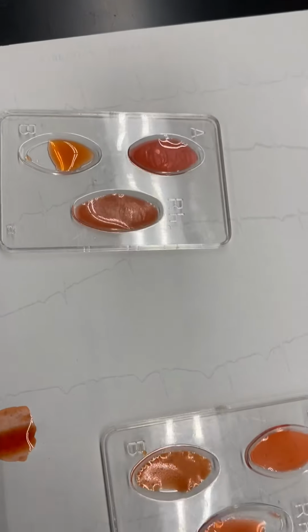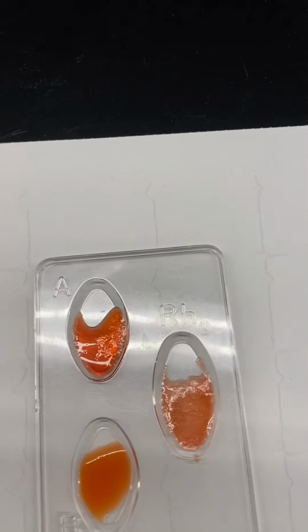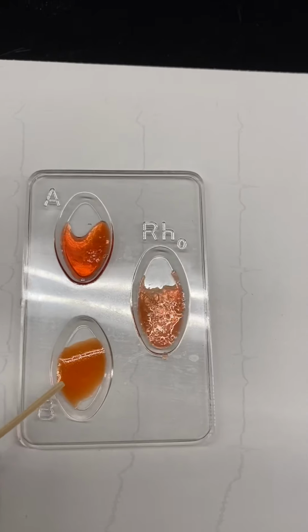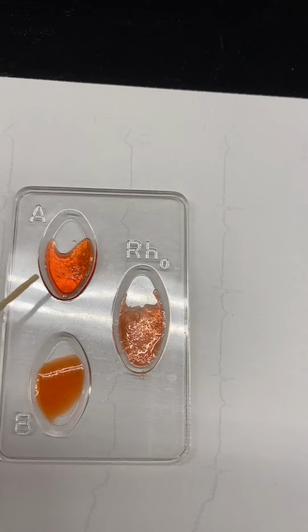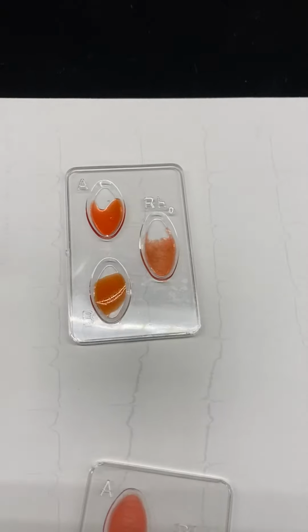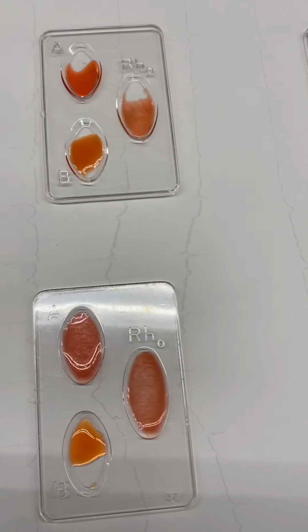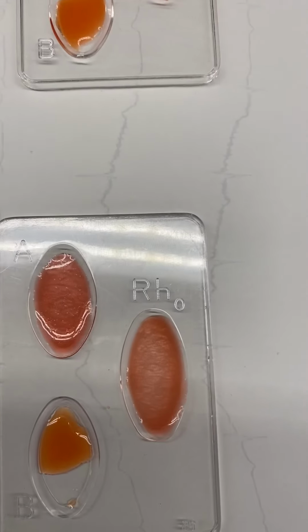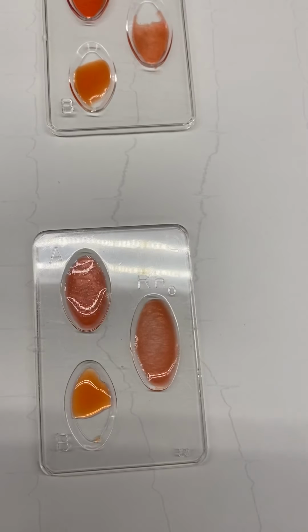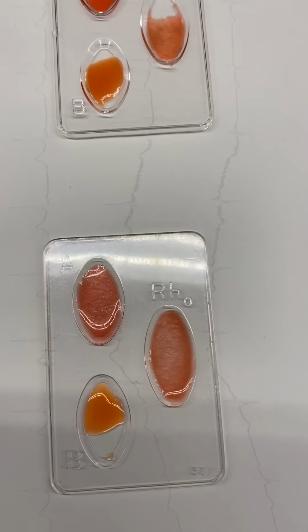So I just wanted to take a moment and actually go back to the first sample we did, because now that it's been left alone, we saw changes in the first sample we did. We saw changes in B and RH, and now that it's sat for a bit, we're also seeing changes in A as well. So guys, here is your lab results. You go ahead and take a look at this, and based on this data, you can make your own conclusion as far as where you see the changes happening, okay? And again, look for the pictures in your files for a copy of the video pictures that I'm showing you right now.